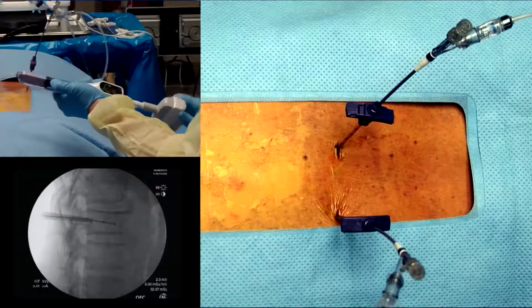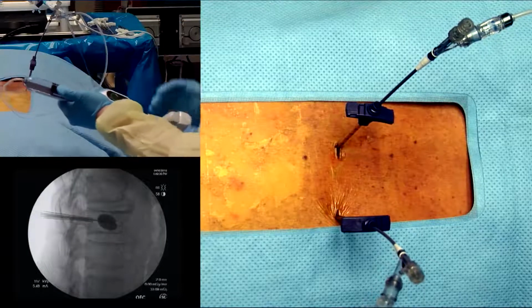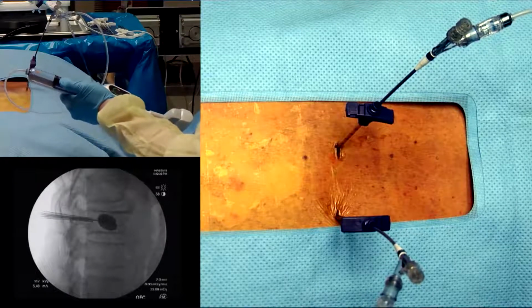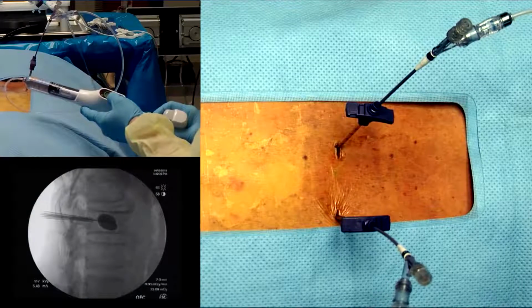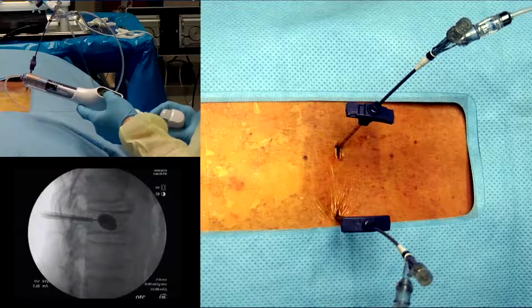So I'm at 2 cc's now, so let's take a look at that, picture that. You can already see that it's starting to tamp that vertebral body up. This cadaver does actually have a real vertebral compression fracture. It's a mild wedge-shaped deformity. And I'm looking at right now the PSI is at 191. This can go up to 700 PSI, so it's very powerful.